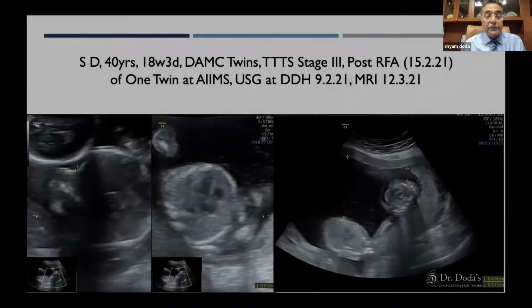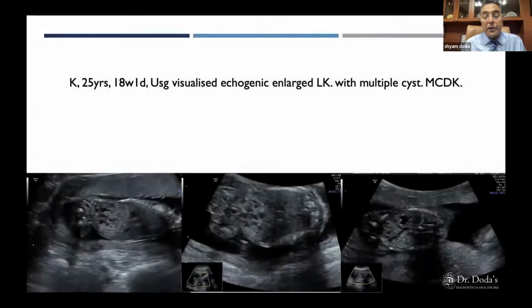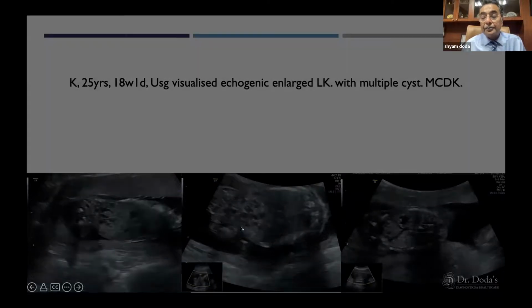The same patient, of course, ultrasound pictures we took later on after MR, since the patient had come from outside and it was already labeled as multicystic dysplastic kidney, but wanted a second opinion. And you can see dysplastic large kidney over there.